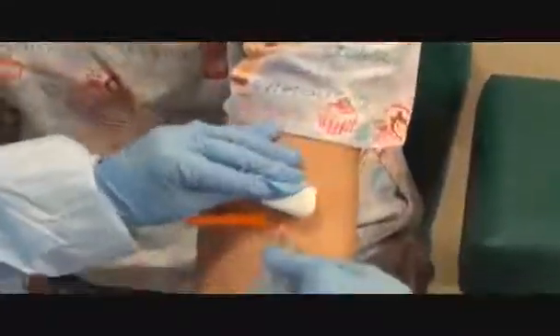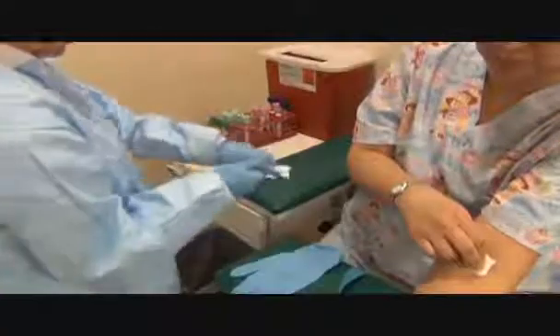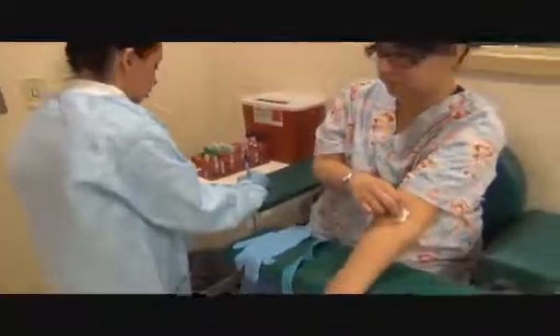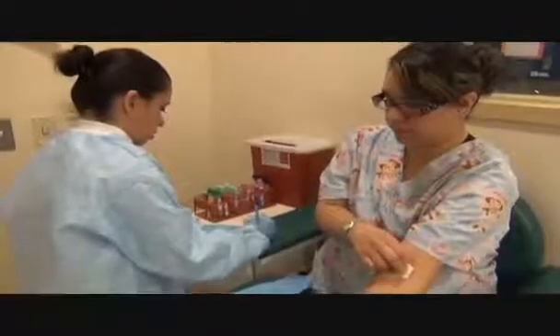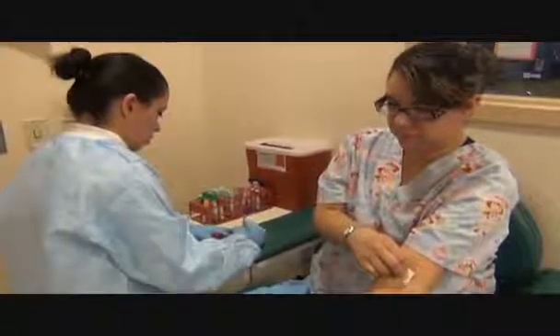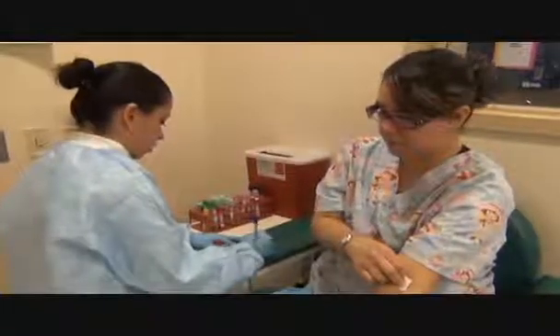Pulling out the needle, activating it on a surface away from me, not crossing over. Please apply pressure. I am now adding the medical record number, the date, and my initials along with the time. And the tests.